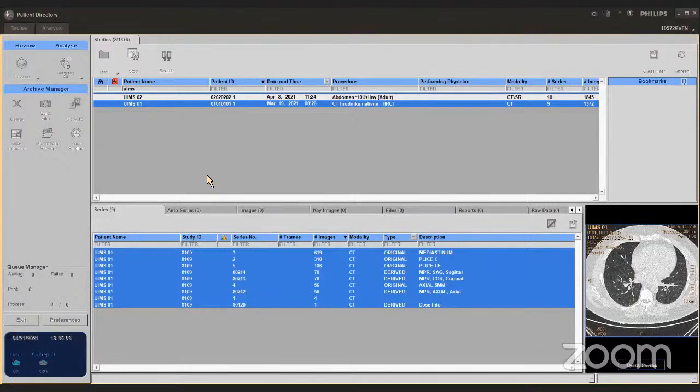We get some raw data, and from the raw data from the machine, we compute these data sets. If you look at the picture here, you can see we have a thickness of 0.9 millimeters. These are so-called thin slices. 0.9 is really thin. Sometimes you can have 0.7, 0.6 with newer machines, but 0.9 is quite nice. Some older machines usually work with 1.5 millimeters and so on.